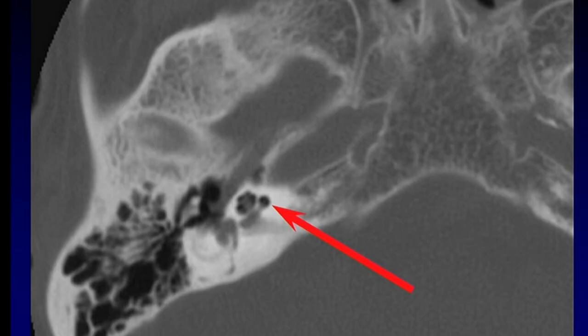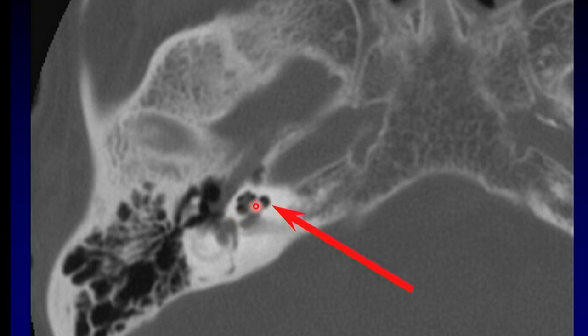One other important thing to look for in otic capsule violating fractures is to make sure you haven't had leak of the endolymph and perilymph out of the inner ear with replacement of gas from the middle ear. This is a perilymphatic fistula. If you see gas in the cochlea or vestibule, that's indicative of a perilymphatic fistula, which is a very severe complication of these otic capsule violating fractures.